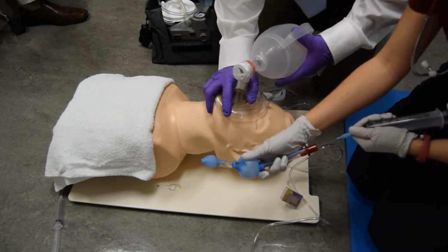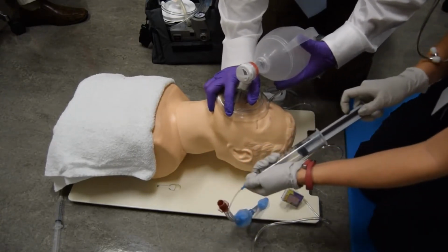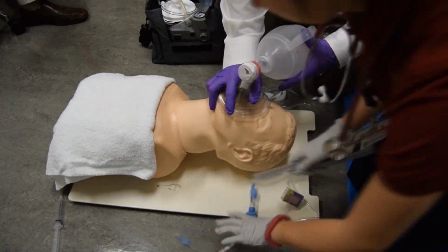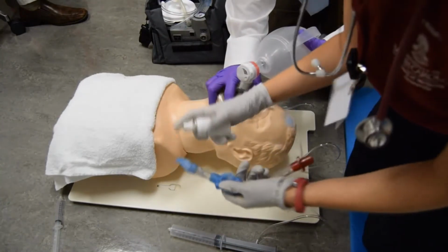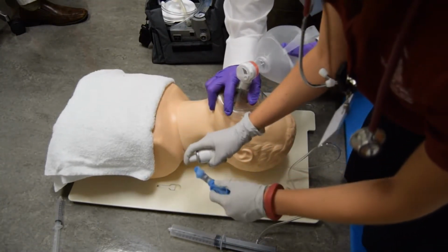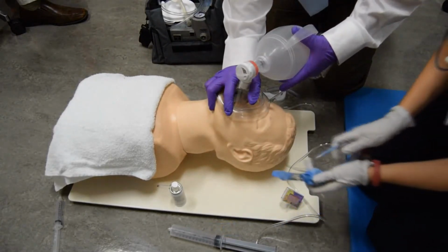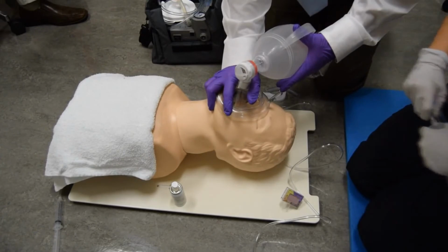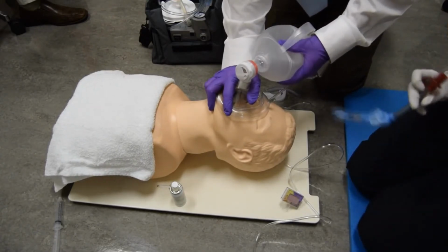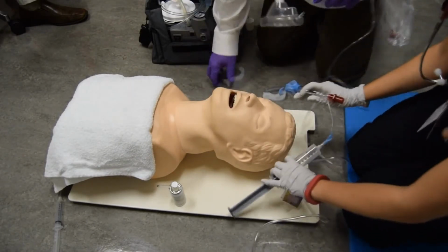Checking for leaks, no leaks. Lubricates distal tip of the device. Examiner to remove OPA and move out of the way when candidate is prepared to insert device. I'm prepared to insert the device. Positions head properly.